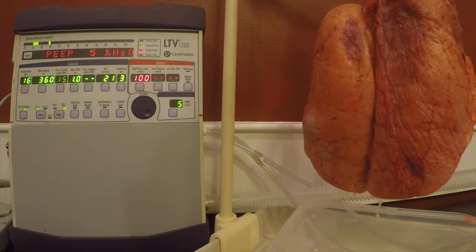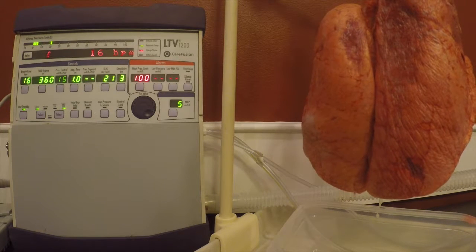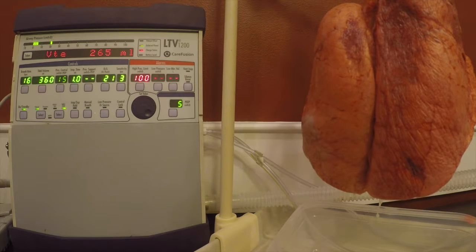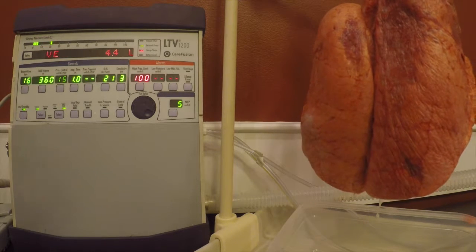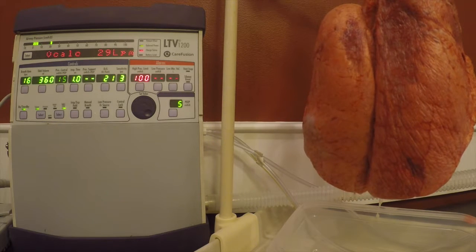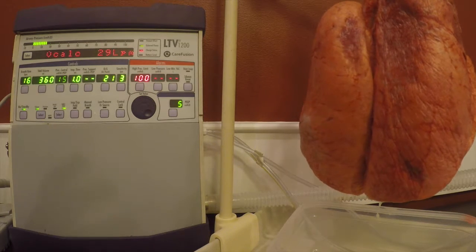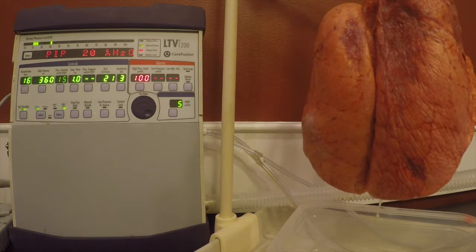The difference between the LTV1200 and the Revell ventilator is the setup. If you look at the Revell ventilator setup for non-invasive positive pressure ventilation in both BiPAP and CPAP, you remember that we have to start with that in the startup menu. The LTV1200 is actually much different — we can actually have the ventilator running and then go straight into that mode.